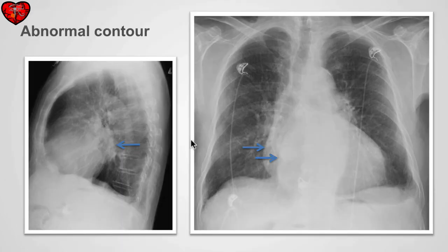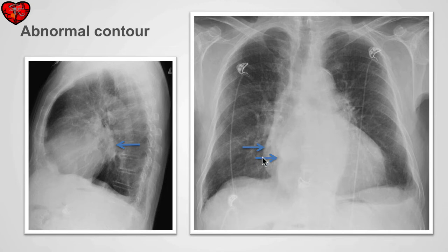The contour of the heart can also be abnormal. Here we have an enlarged cardiothoracic ratio, but we can also identify not one but two right heart edges — one formed by the right atrium and a second formed by an enlarged left atrium. The enlarged left atrium can be confirmed on the lateral view, seen as an outpouching from the superior aspect of the cardiac contour.